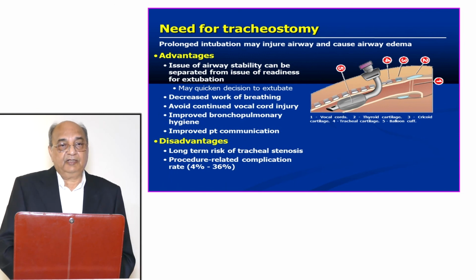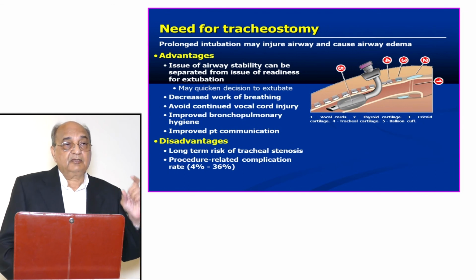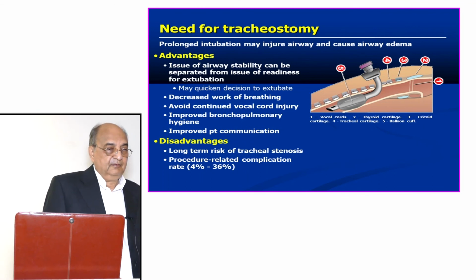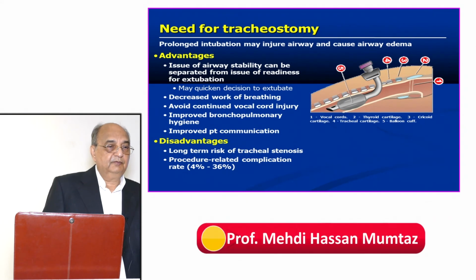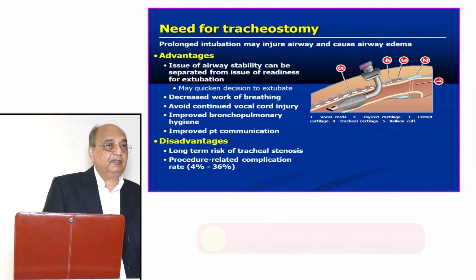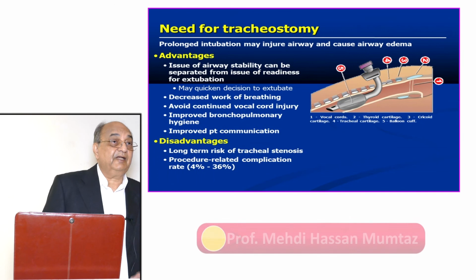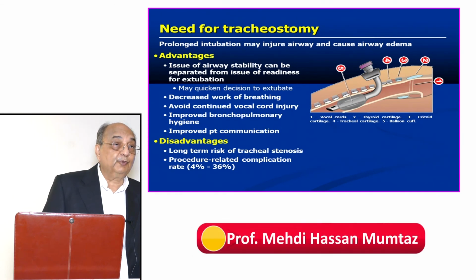So when the patient comes to that stage, you are required to deflate the cuff. But always remember, you have got a cuff, whether it is an endotracheal tube or a tracheostomy tube. Above the cuff there is a collection of secretions. What are those secretions? Those secretions come from salivary secretions, and salivary secretions are alkaline, and an alkaline medium is very good for the growth of bacteria. So they are infected secretions. If you release the cuff without sucking them, all the secretions will go to the lung, and this is the most important cause of ventilator associated pneumonia.